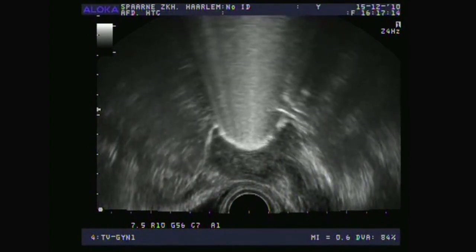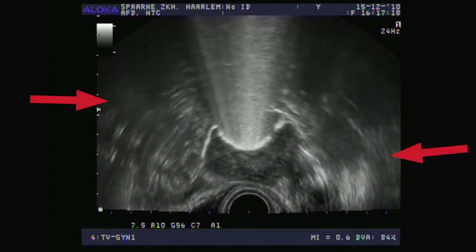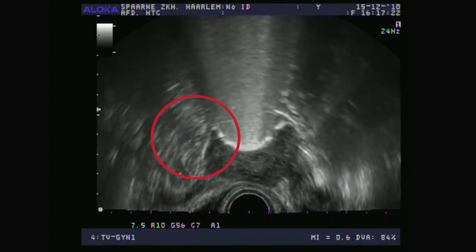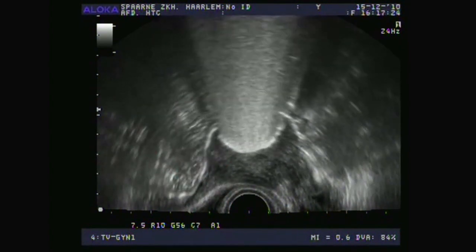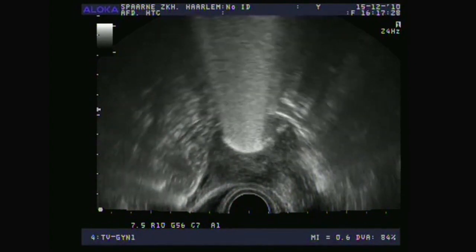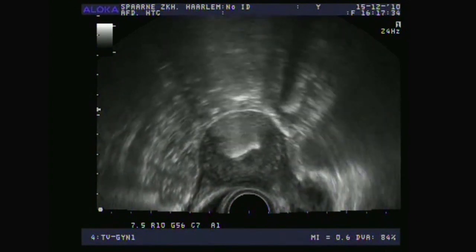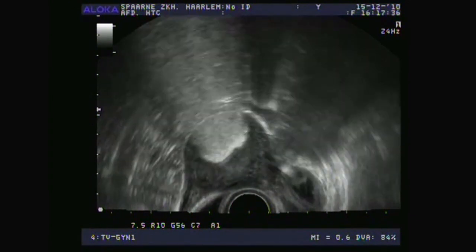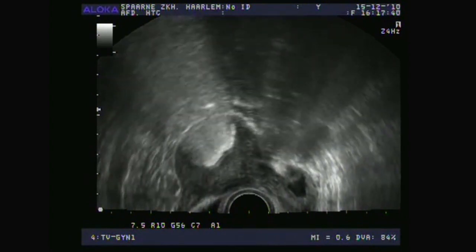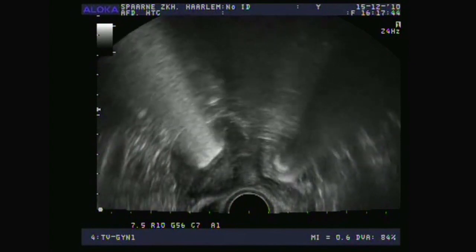This is the transversal cross-section, and you can see that this is the right and this is the left — the right fallopian tube is filled immediately. Then we focus on this right fallopian tube where you will see the foam appear in a moment. It will really overflow into the abdominal cavity. Even if this doesn't happen and you can only see a nice thin slender fallopian tube, it still means that it's open. After all, a blocked fallopian tube could never produce such a very nice thin slender reflection.